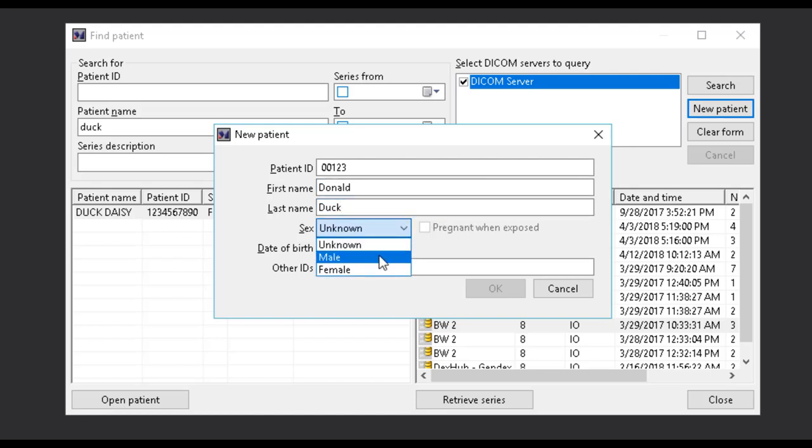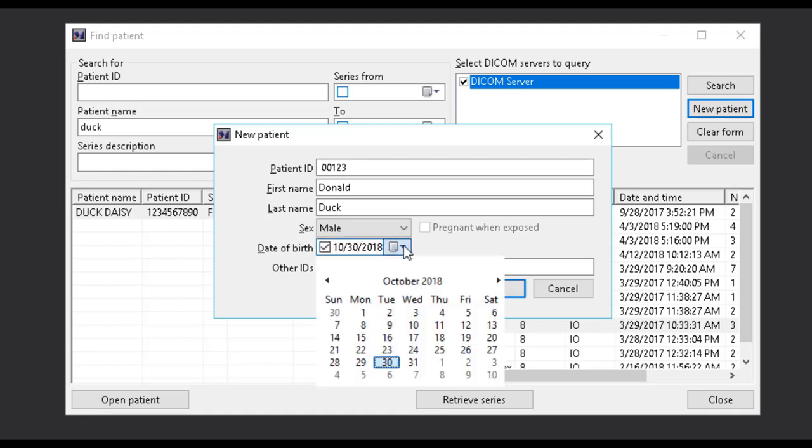You can use the graphical interface to find the correct date or you can simply type the date in.